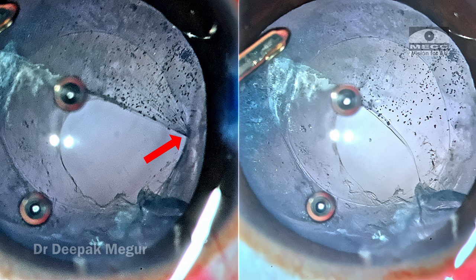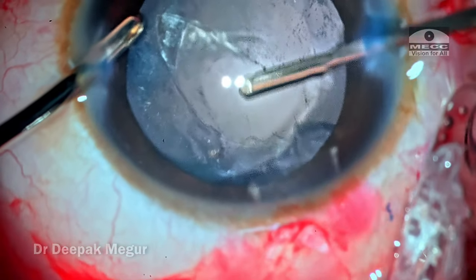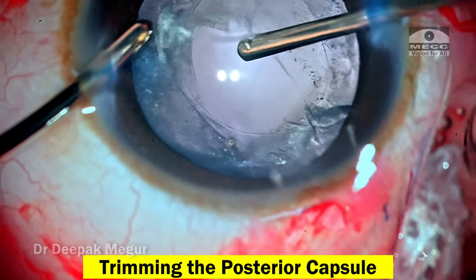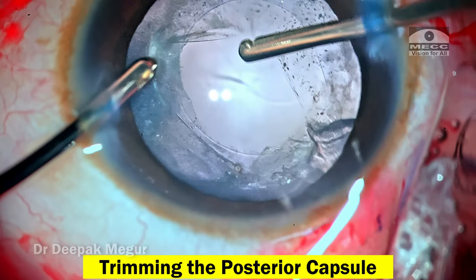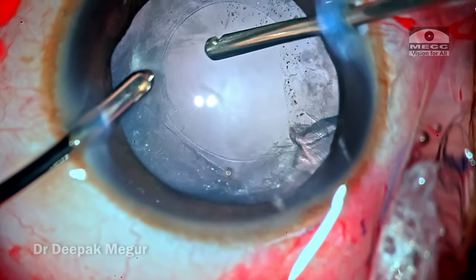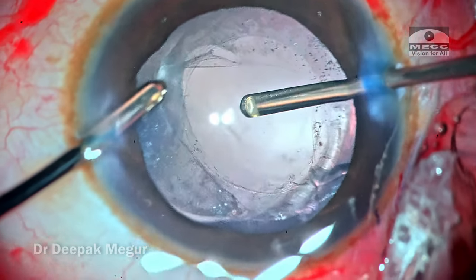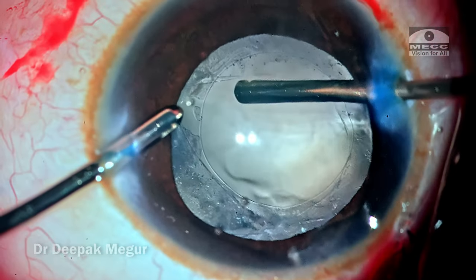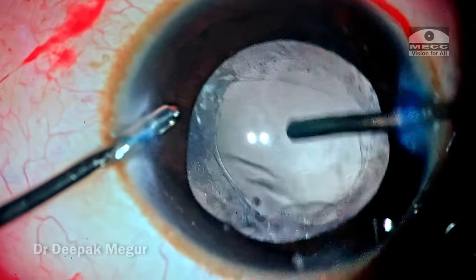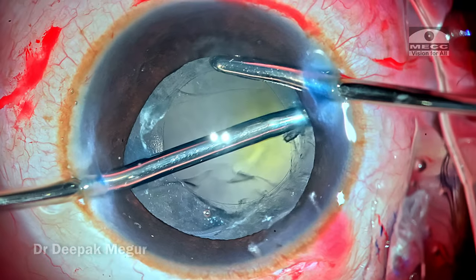I proceed with vitrectomy, getting across the thickened anterior hyaloid, while also trimming the posterior capsule so that the visual axis is cleared and there is no posterior capsule in the visual axis. Once the vitreous is clear, the remaining cortex is aspirated out.